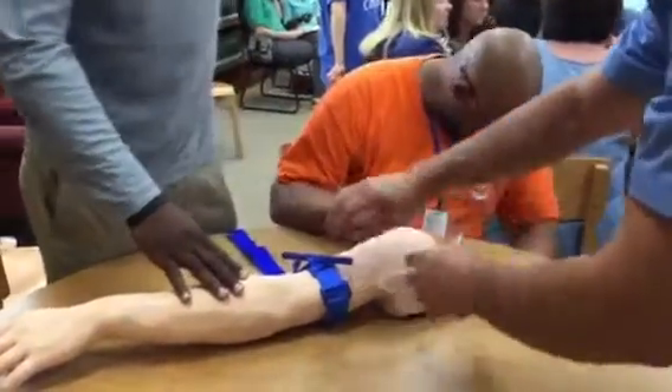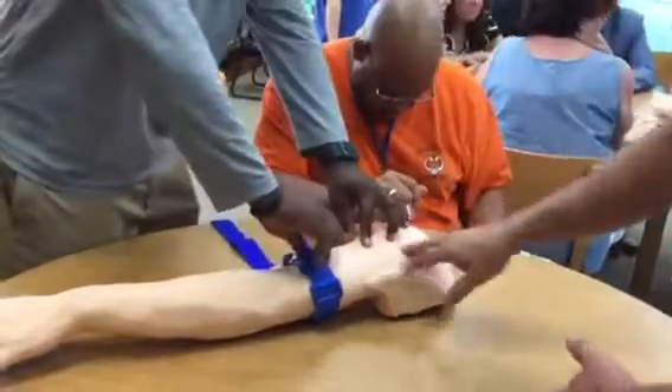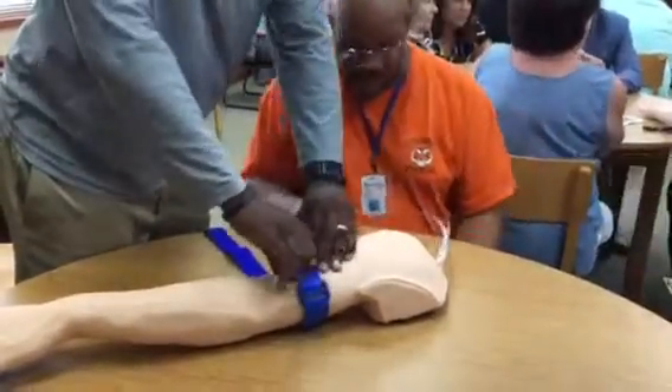He's pulling it tight. At this point you're ready to start tightening it up. So you're going to take this and twist the windlass — it's going to make some difference. And you're going to twist it a lot.